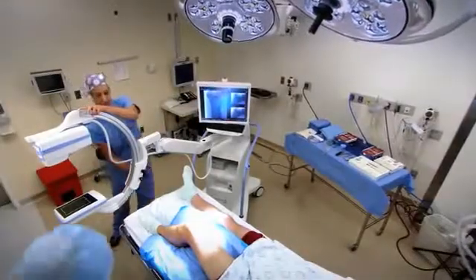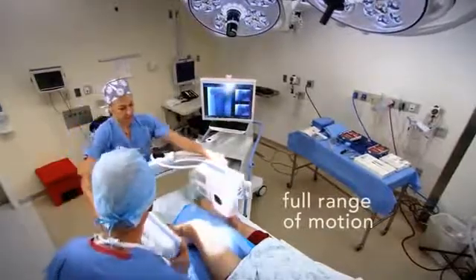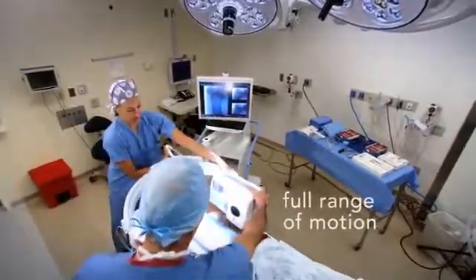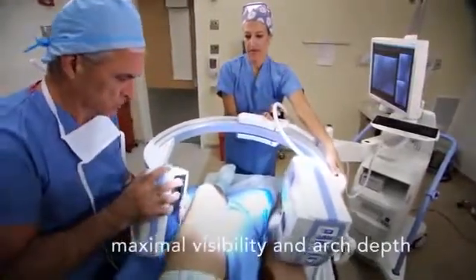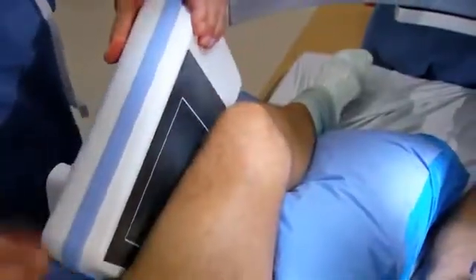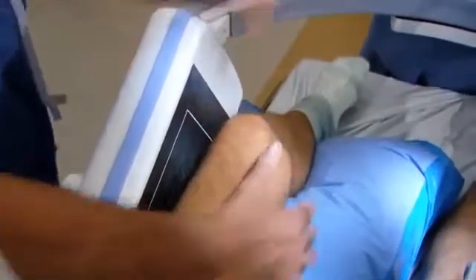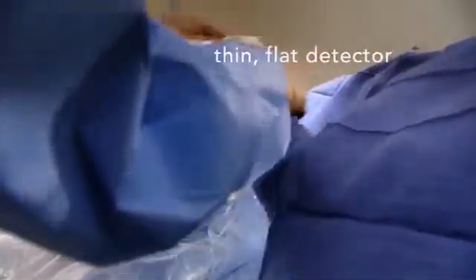The C-arm itself is newly redesigned to give you a full range of motion for the most flexibility and positioning. The tube source has been redesigned and repositioned to maximize surgical visibility and arch depth. The new flat detector has a very thin profile to improve working space and patient positioning.